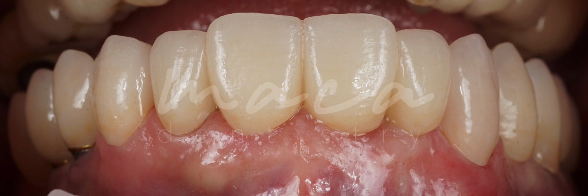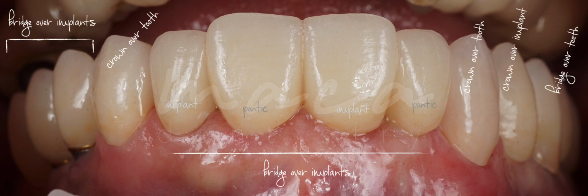This is the final result. Here you can see the different restorative work. From 17 to 15 we have a bridge over teeth. On the 14 we have a crown over implant. On the 13 and 23 we have single crowns over teeth. From 12 to 22 we have a bridge over implants, the pontics being the 12 and 21. And from 24 to 26 we have a bridge over implants.